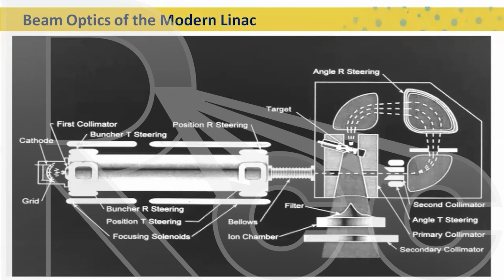And it has the same quality as a photon beam, as a linear accelerator X-ray beam, but its advantage is it's the same everywhere. It never changes. Cobalt is cobalt is cobalt. The energy is precise. So the scientists that came up with the different calibration protocols knew that they had to have a standard. They came up with two things that you can never change. Cobalt, the energy of the cobalt, always the same, never changes. And water. Water is the same everywhere. Fresh water taken from the tap, the same everywhere.